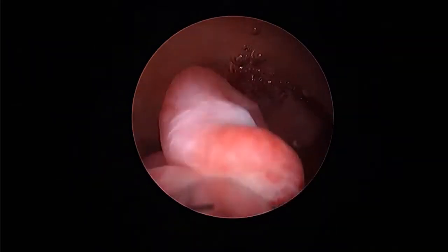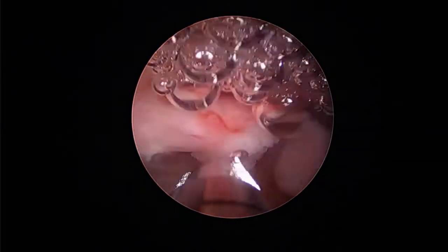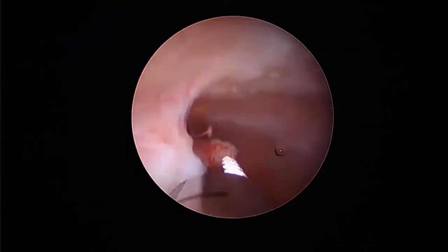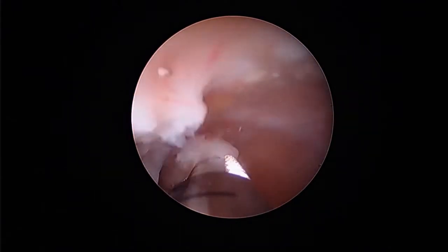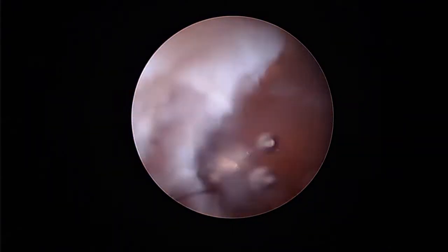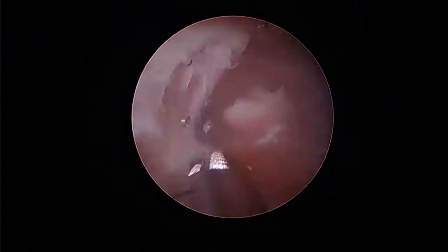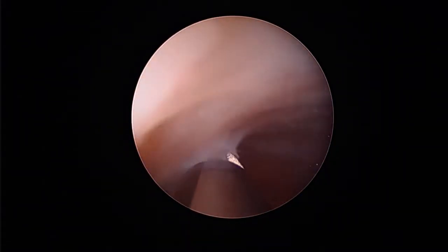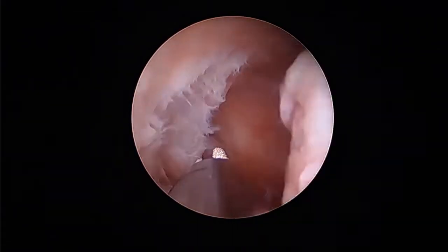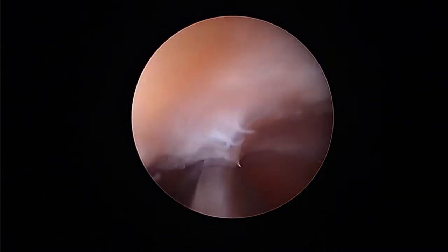Hysteroscopic polypectomy is a common procedure for the gynecological surgeon. Here we've introduced a morcellator through the hysteroscope after we have identified bilateral tubal ostea, which is an absolute requirement when performing hysteroscopic surgery.